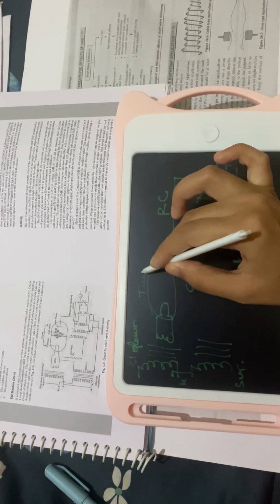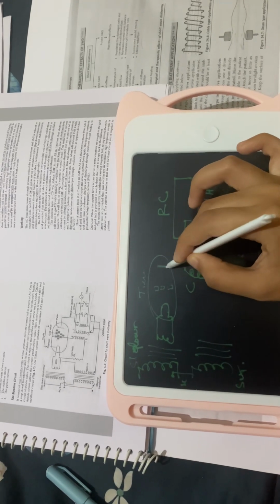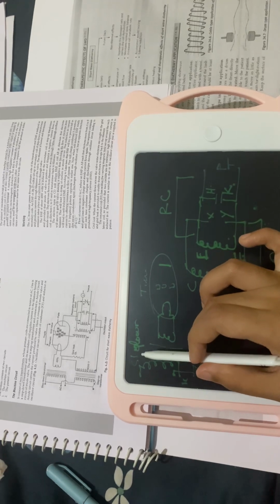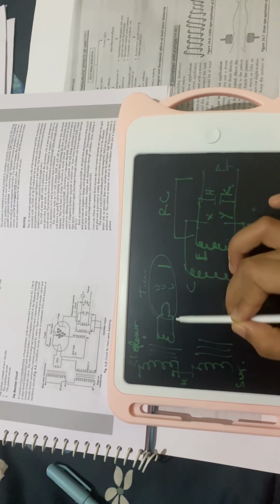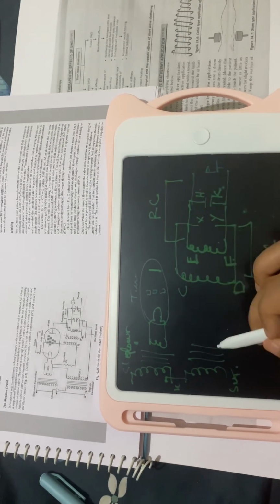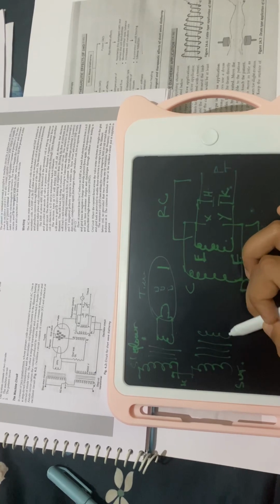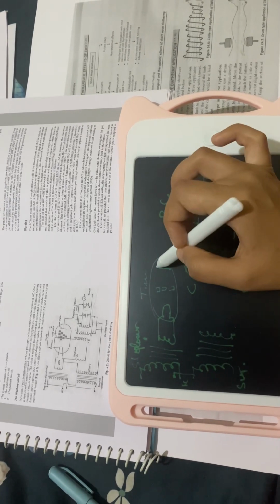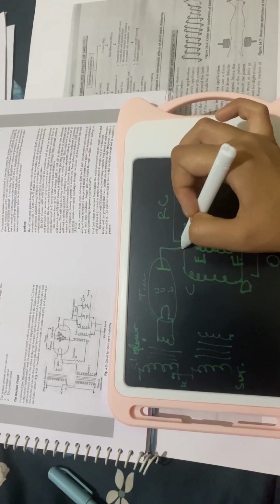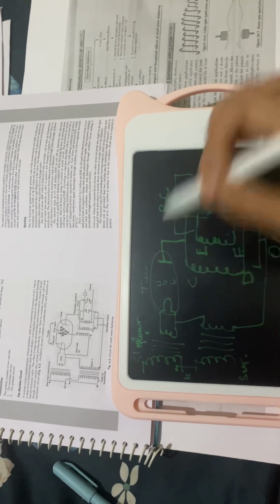The triode valve has three electrodes, a cathode, a grid and an anode. So the secondary coil of the step down transformer is connected to the filament of the triode valve. The secondary coil of the step up transformer is connected to the anode circuit. How is the anode circuit connected? It is connected to the oscillator circuit and back to the filament.